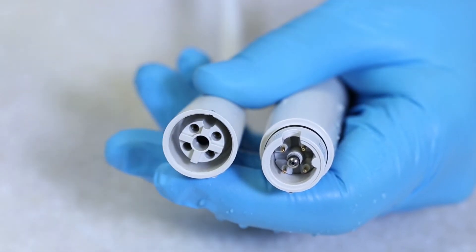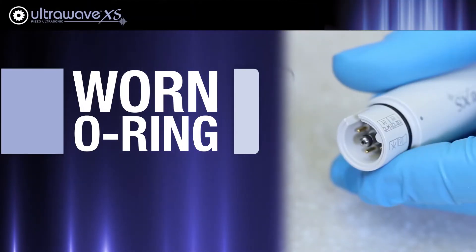Another possible cause is a worn O-ring on the handpiece. To replace the O-ring, refer to your handpiece instructions section 7.1.5 for a step-by-step guide for using the F12304 seal replacement kit.